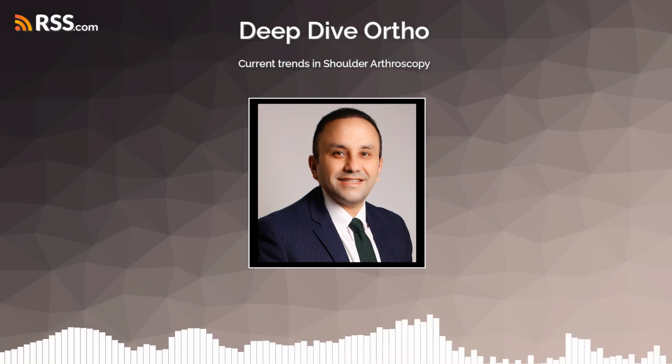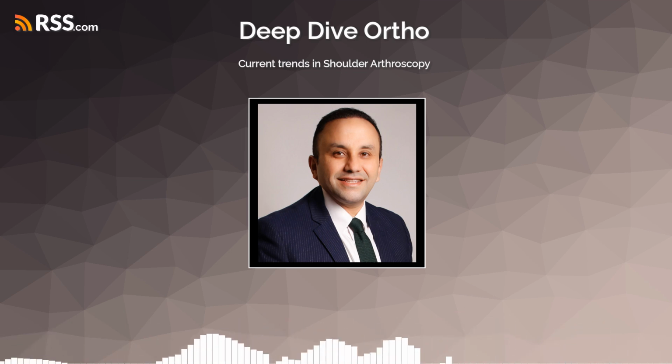So how do you fix that looseness? Arthroscopic capsular plication, or ACP, is a surgical technique used to address this. It involves taking tucks or pleats in the joint capsule to effectively tighten it up and reduce the excessive laxity.